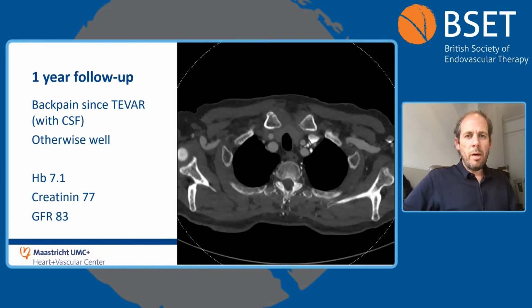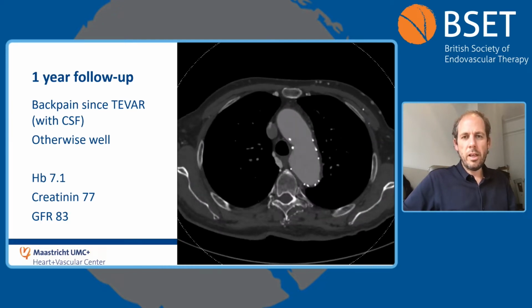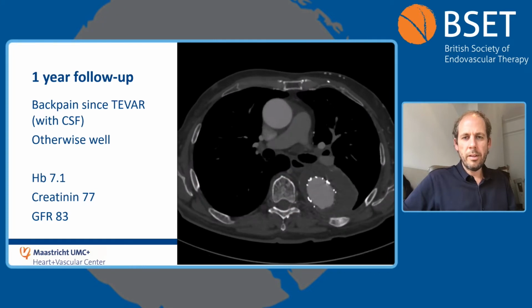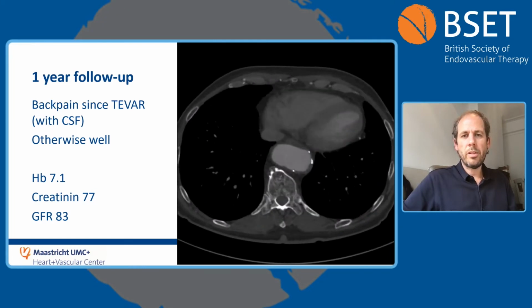At 1 year follow-up, he suffered a bit from back pain since the TEVAR. We suspected this due to, or he suspected this due, and maybe us as well, to the CSF drain, but was otherwise well with the laboratory values you can appreciate. And his CT scan is like this, demonstrating actually a good position of the thoracic endograft.